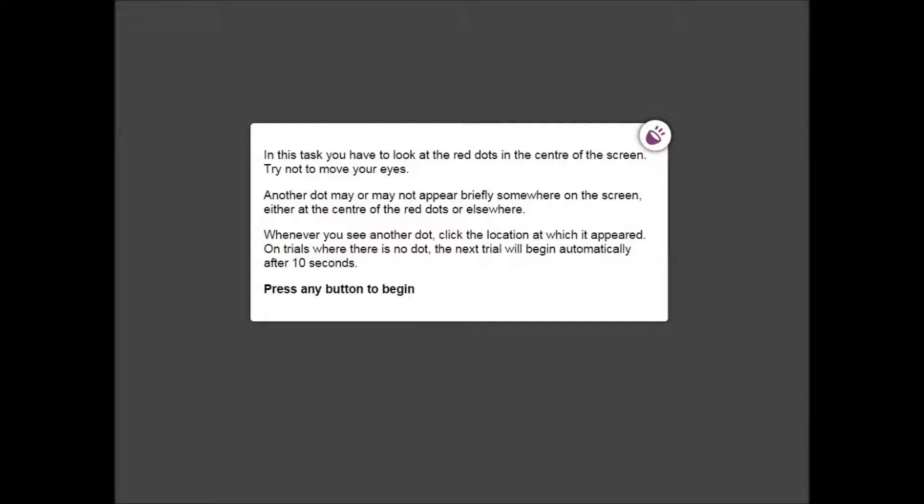The next screen you will be presented with are the instructions for the Perimetry Assessment. In this assessment you are required to look at the four red dots in the centre of the screen. Try not to move your eyes around the screen and remain looking at these four red dots.